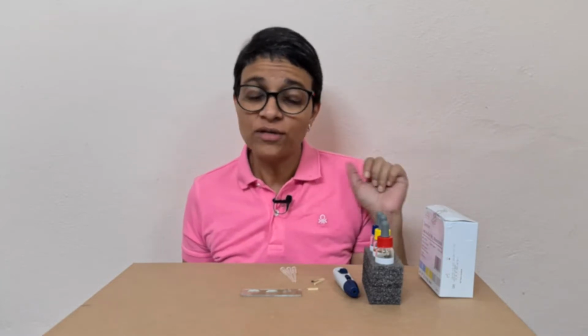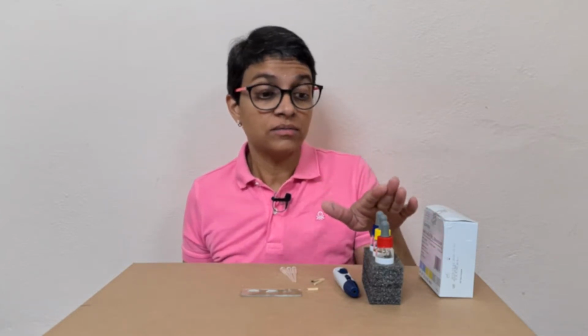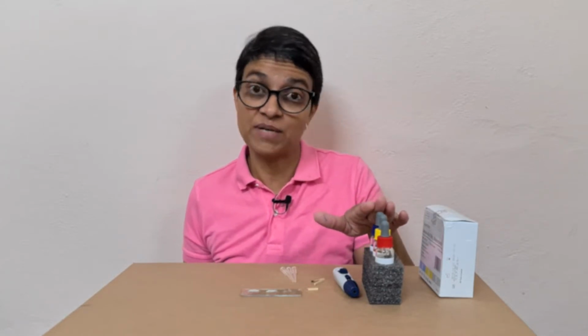Why only ABO blood grouping? Because ABO blood groups are the most significant blood groups which are used for testing compatibility during blood transfusions and organ transplants. I'll be bilingual for the benefit of the local students.